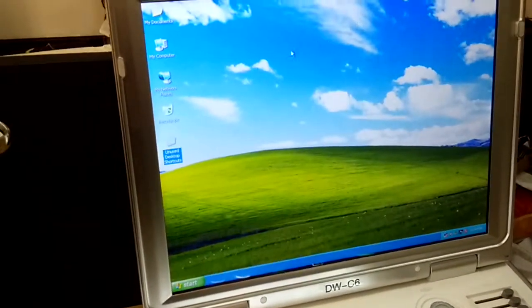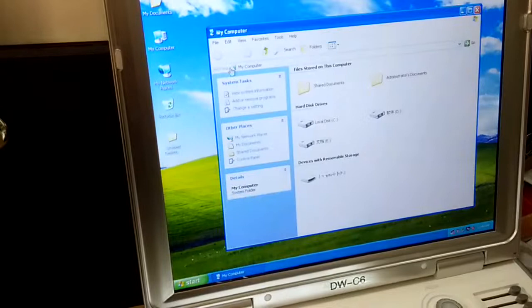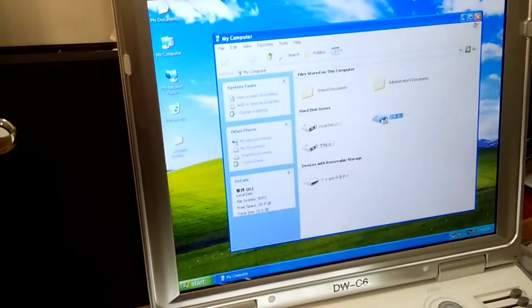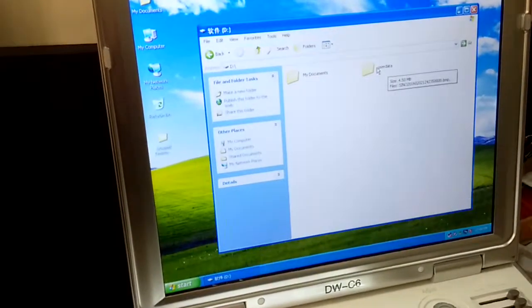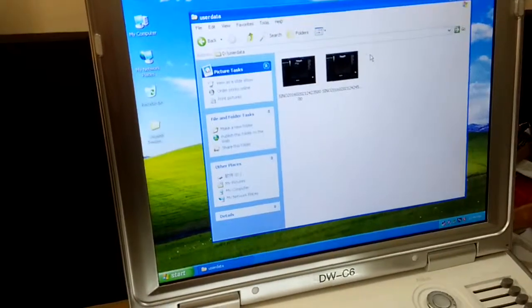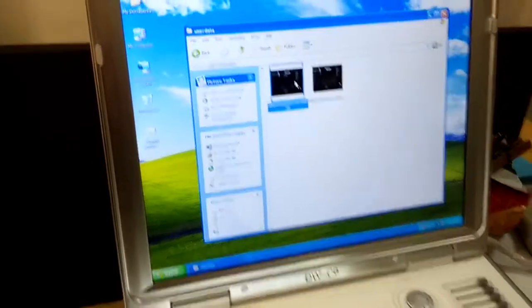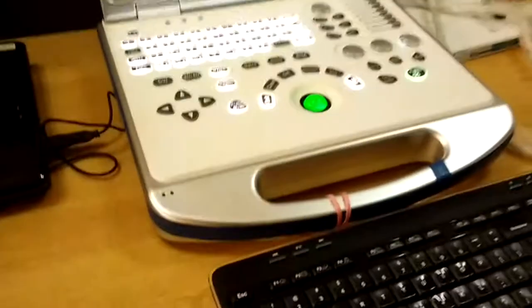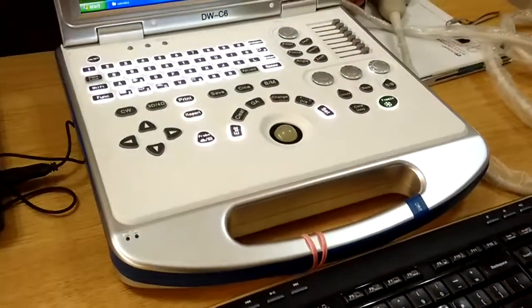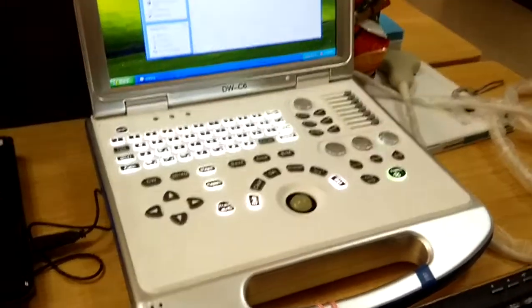Then you can open My Computer, go to Disk D, open User Data, and then you can see the image you saved before. Then you can just use the keyboard to copy the image to your flash disk.